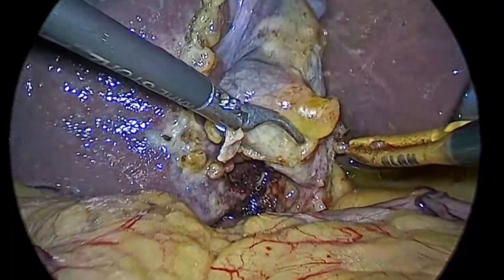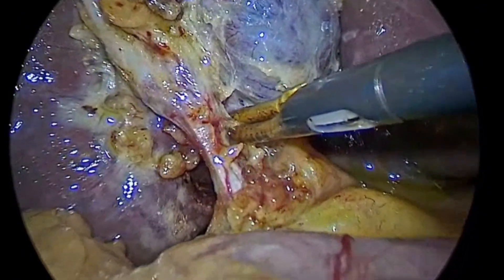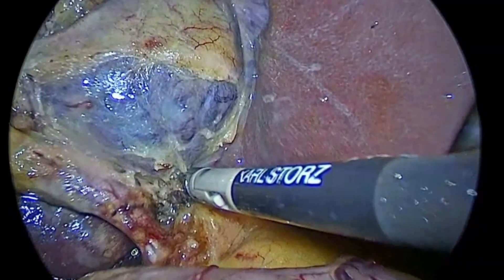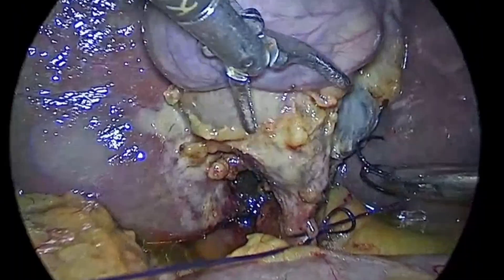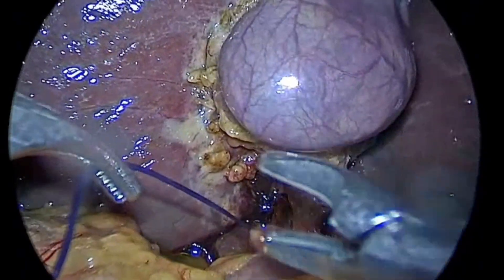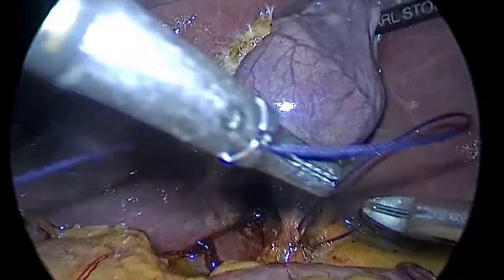The cystic duct seems to be short. I think this is the extent of it, so we do not want to risk going further down. I can see — keeping it so that I do not ligate the confluence of the common hepatic duct and common bile duct. Intracorporeal knotting is not so difficult if you follow the rules.